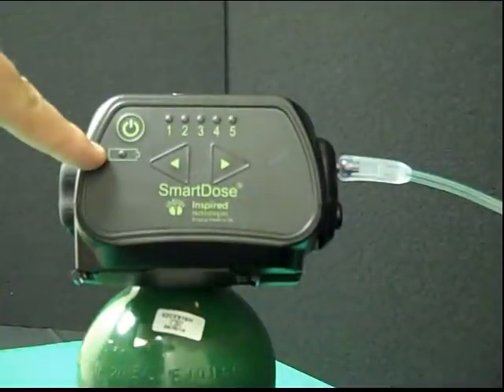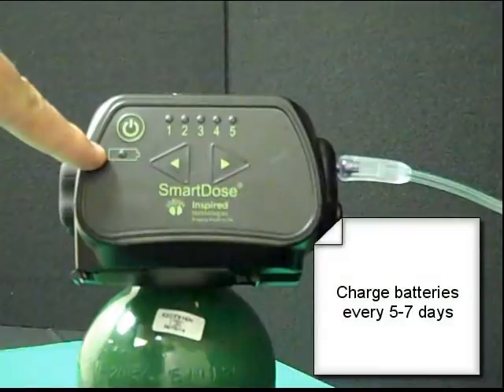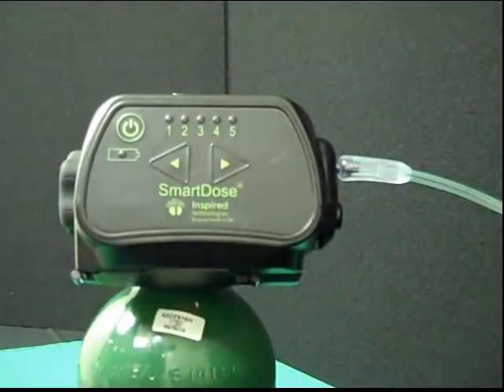In the event that the batteries get low, the battery LED will blink as a warning and then will turn solid red when the batteries are too low to operate the unit. Each unit is shipped with rechargeable batteries and a charger. Batteries will need to be charged approximately every five to seven days. But if the batteries go low while a user is out, simply switch to continuous flow and change the batteries with standard AA alkaline batteries.